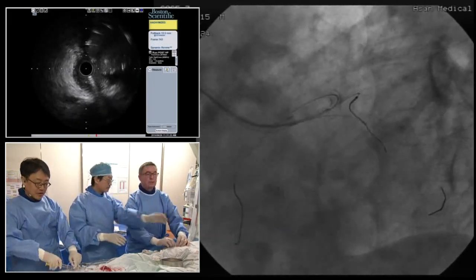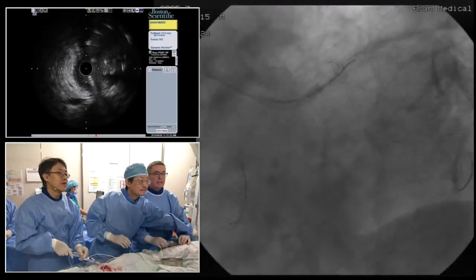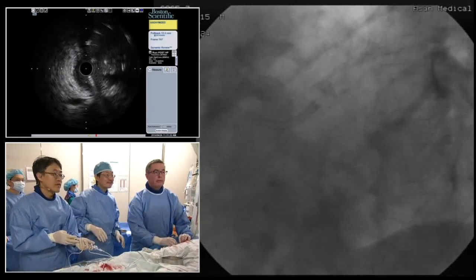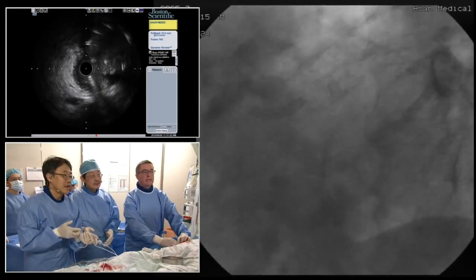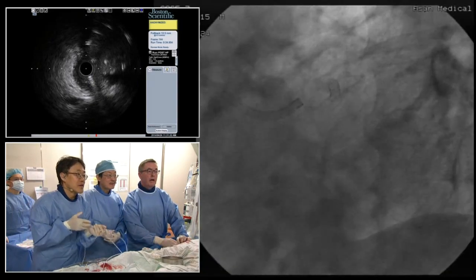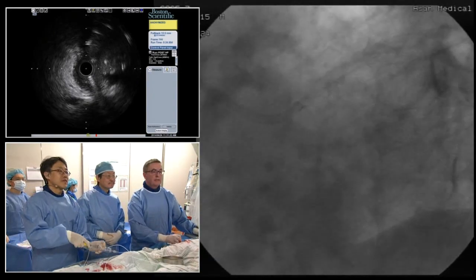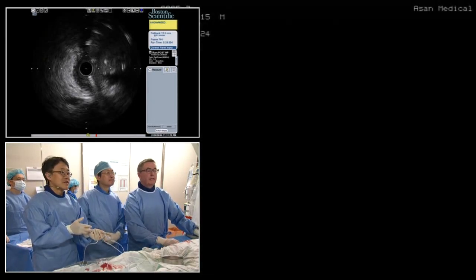So Ian, if you want to do a final angio for us. Yeah, well, what we'll do is we'll take the wires out. I'm going to take all the wires out, and we'll give you a nice final shot. I'll just pull them back into the guide. Hang on a second. There you go. Now, wait. There you go. You ready? No, it's 1 second to see the stent, and then take the shot. Okay, sorry. Okay, good. Perfect. Ready? Yep.